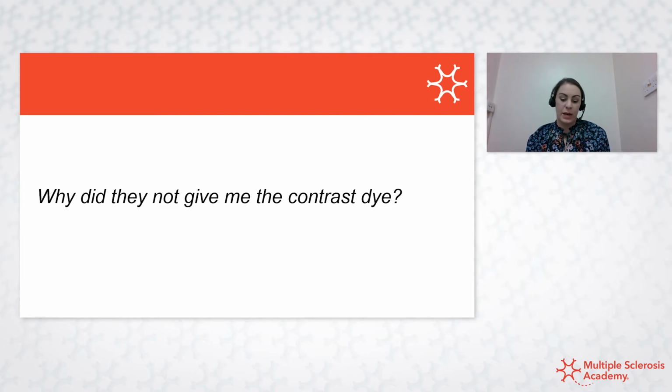The most obvious reason is if someone's pregnant, of course, or potentially breastfeeding, although I know if a lady is breastfeeding and they need a postpartum re-baseline scan, they can express and get rid of that milk. But what I thought mostly was the fact that if it's a routine scan to see whether a disease-modifying therapy is working, they haven't necessarily got clinical signs or symptoms, so activity may not be expected.